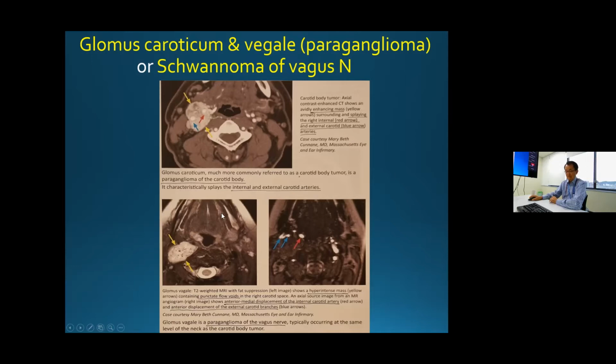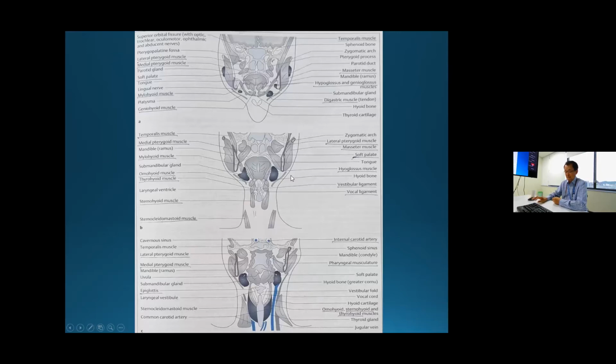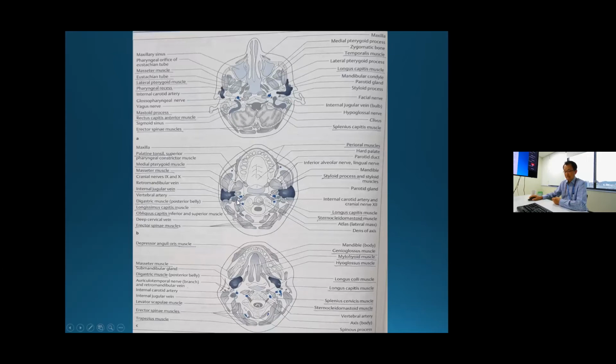So this is a mass, usually greater than 3 centimeters we call a mass, less than 3 a nodule. You measure here, and the shape is irregular, and the margin is smooth. A smooth margin indicates benign things, and heterogeneity is the hallmark of malignant tumor. So right side, the carotid space. This is all a diagram of detailed anatomical landmarks, on the axial you can see all things. So you have to learn this kind of thing.